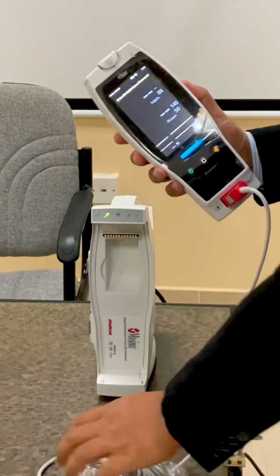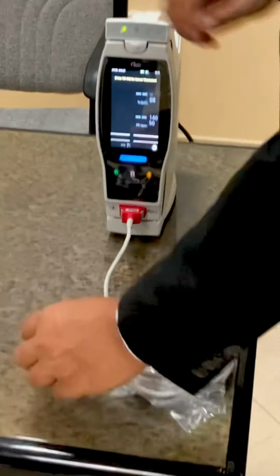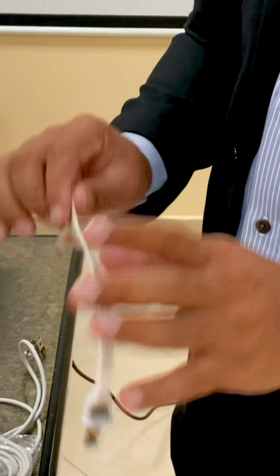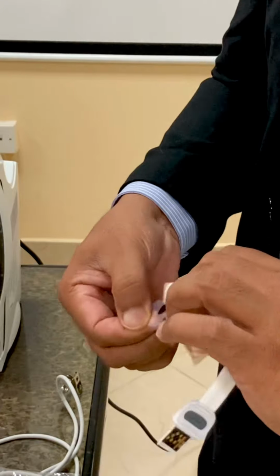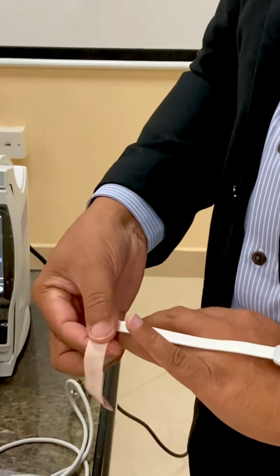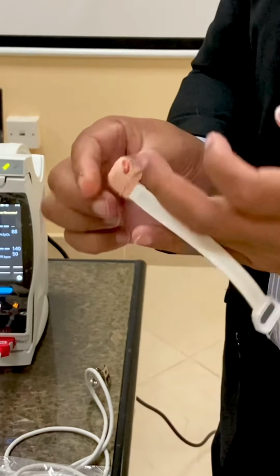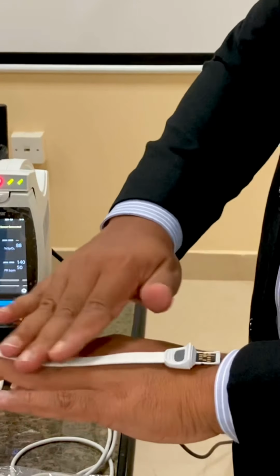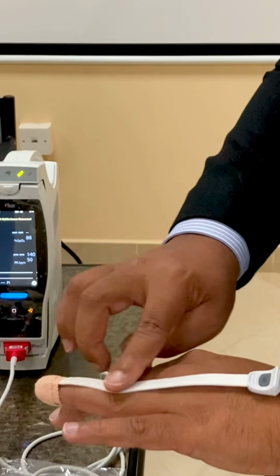Yeah. The patient cable is connected. I'll make it on the system. Now the sensor is here. I suggest you connect the sensor first, either on digit 4 or digit 3, and then wrap it to avoid external lights like this. Once you connect it, you can see that it will be aligned so that the disturbance to patients will be very little, because the cable is very flat. If it is round, then it will create more.